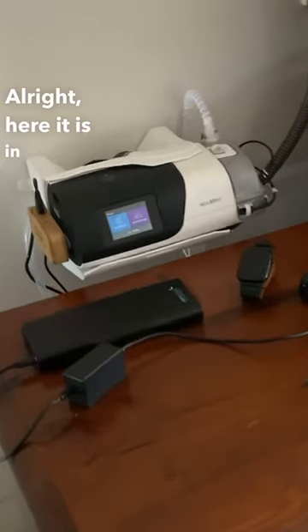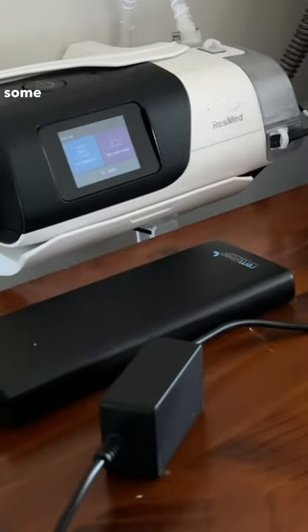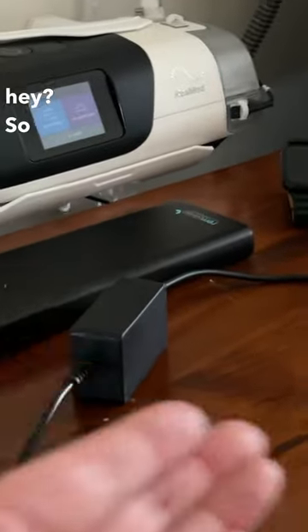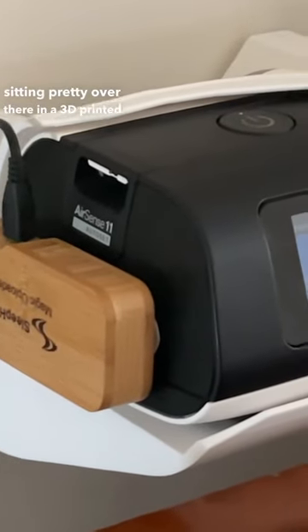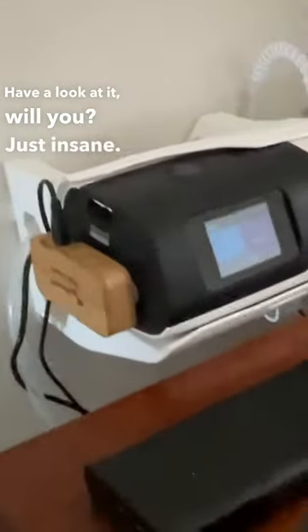All right, here it is in all its glory — check this out. This is what you'll need to be Uncle Nico. Look at this bedside table — look at all this free real estate, so much room for activities! And that's because the AirSense 11 is sitting pretty over there in a 3D-printed wall mount I picked up on Etsy. Have a look at it — just insane, so good.